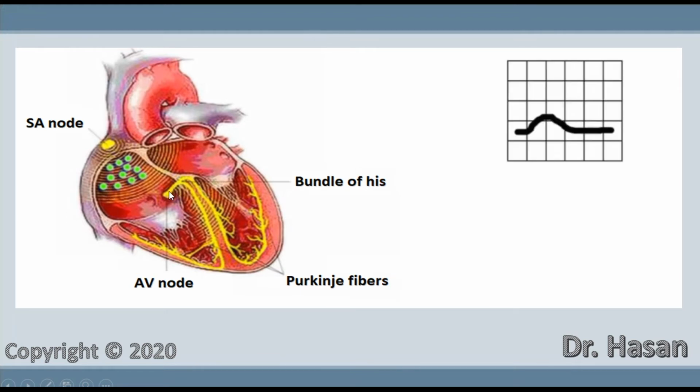Graphically, this can be represented as a kind of excitation wave. It is shown in the figure as a black wave, which has its own peak. Own peak, in other words, is the maximum height. This is the excitement of the right atrium.